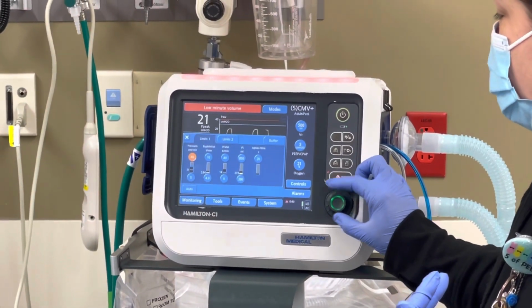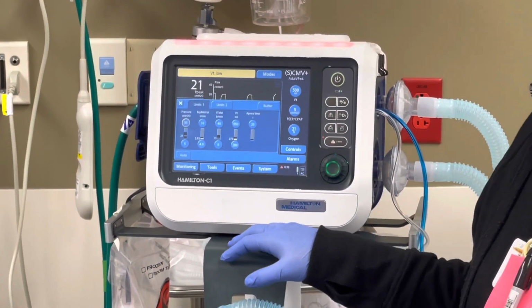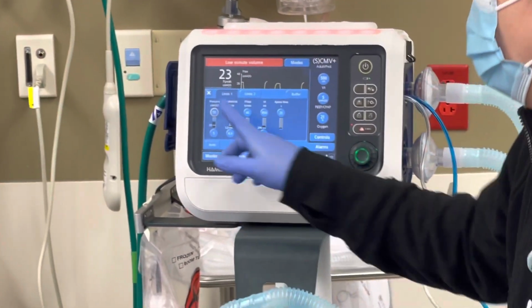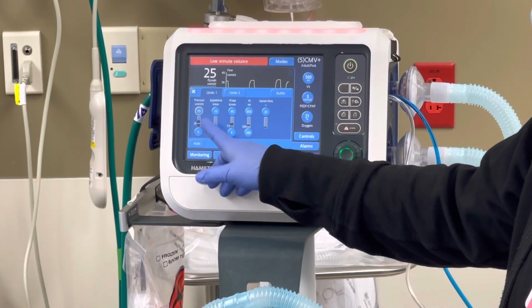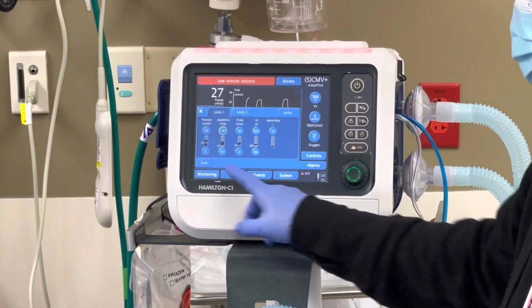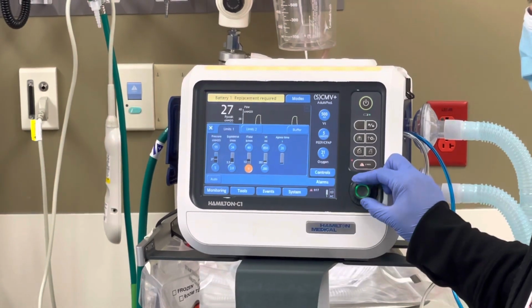I usually start with a preset. Right now, the peak pressure. So for the way I usually do it whenever I start a patient, I will put my peak pressure to 55/5. I will usually do my minute ventilation to 24/2. And then I keep my rate 40/5.